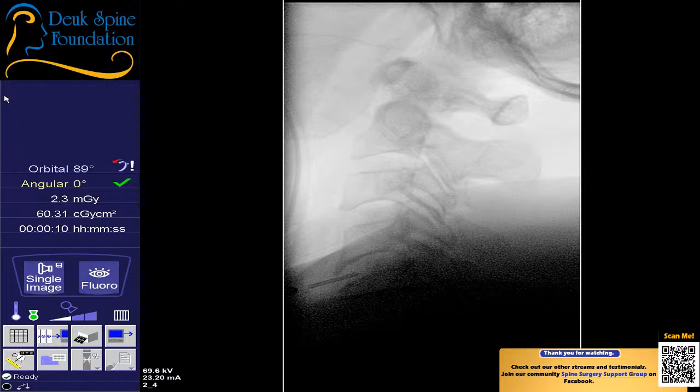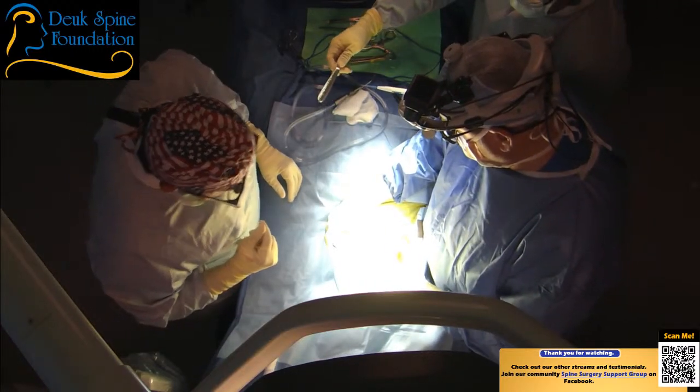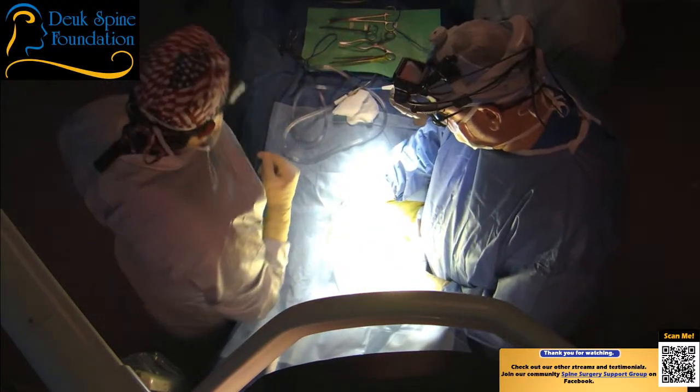Nice job. Stay where you are, Dr. Patel. So that's pretty much, I thought it was either 5, 6 or 4, 5. It's a little high for 5, 6, so I'm happy. We're gonna be okay. But this is seriously the deepest wound. So he takes the cake. Height is, can you see Dr. Patel? I think we're okay. You may need another step up. All right, give me a second, Sean. I wanna focus right here for a minute. I need the lip, please.